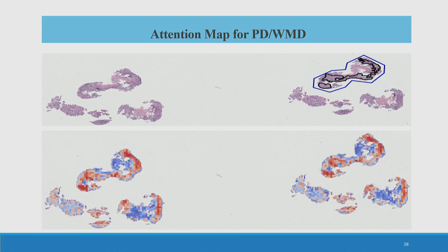And this is for the WMD. This has been annotated by the pathologist. Here you can see our model has also predicted like this in the visualization part.